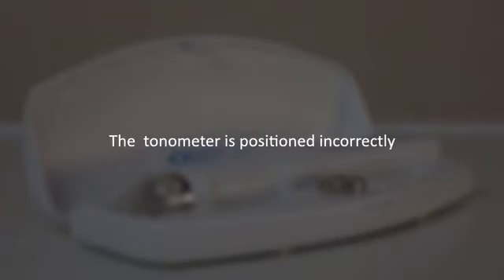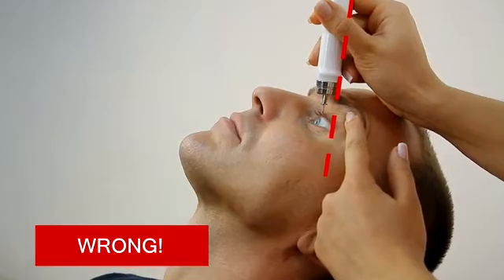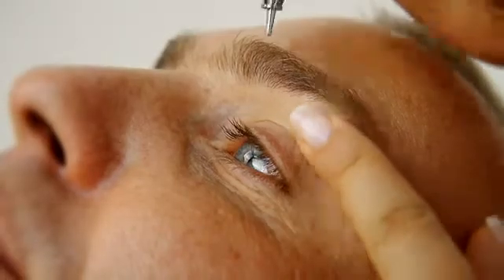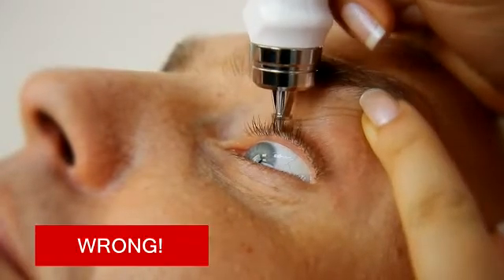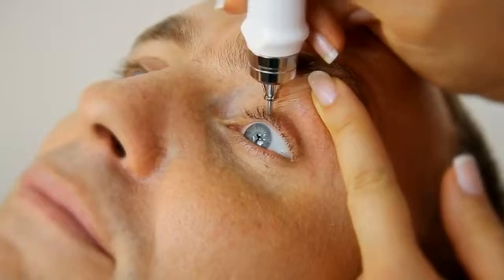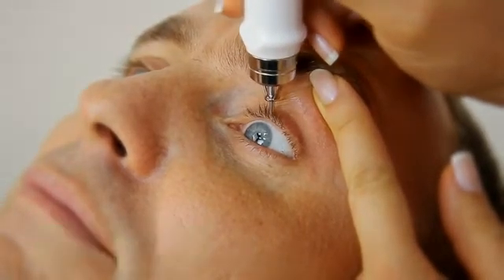The tonometer is positioned incorrectly. The tonometer body deviates from vertical position. The measuring is only done when the tonometer is placed upright. The tonometer is lowered too far down. The protective ring touches the eyelid. The protective ring should not touch the eyelid during measurement, but be placed 2 to 3 millimeters above the eyelid surface.